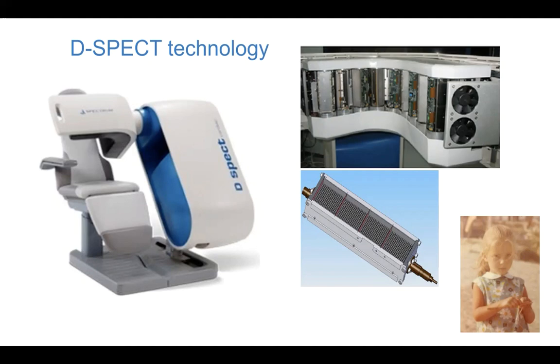Behind each collimator column, there is an array of 2.46 by 2.46 millimeter and 5 millimeter thick CZT crystals. Each detector column can rotate along its long axis up to 110 degrees independently and focuses on the heart region.